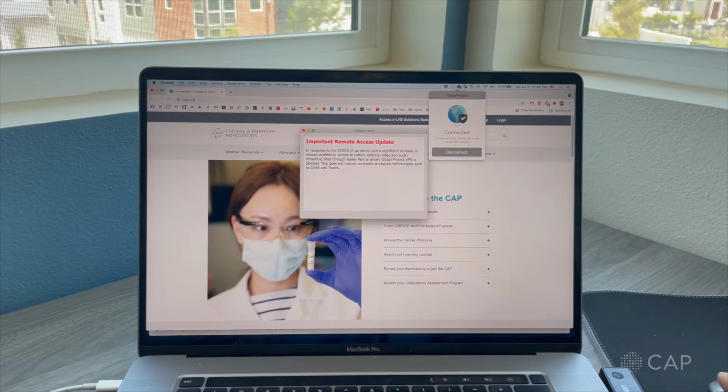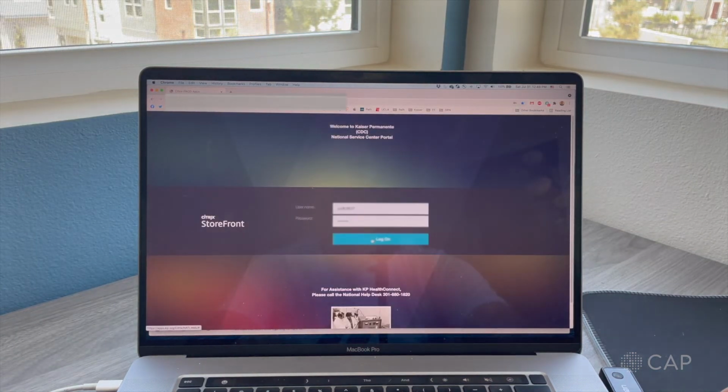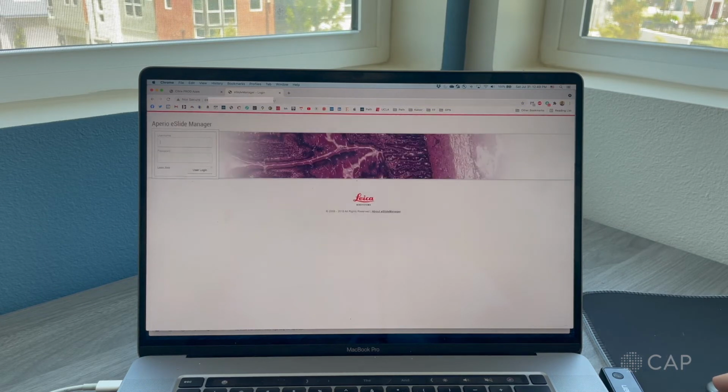Now that I'm inside my institution's network, I can access the same client programs I use at work for the LIS, EMR, and Image Viewer. Our institution has most of these programs on an intranet page that can be launched by a Citrix client. Once I have all the programs set up in my workspace, it's time to log into the Image Viewer.